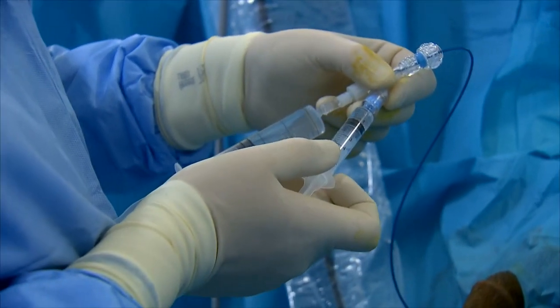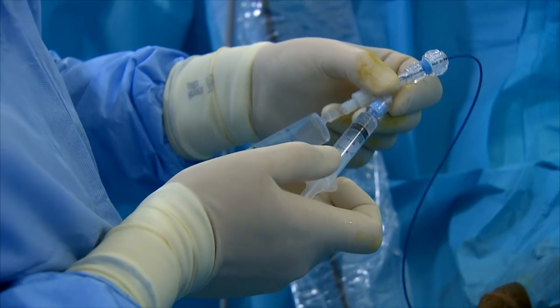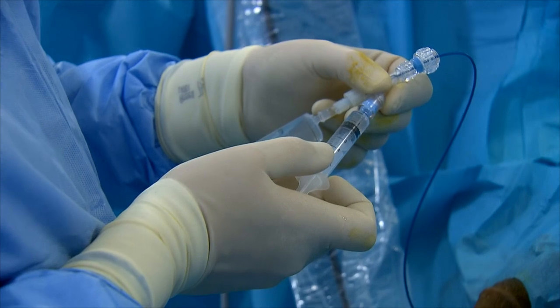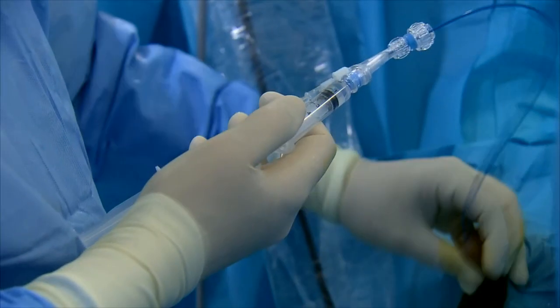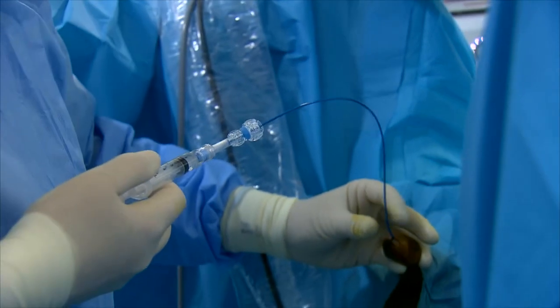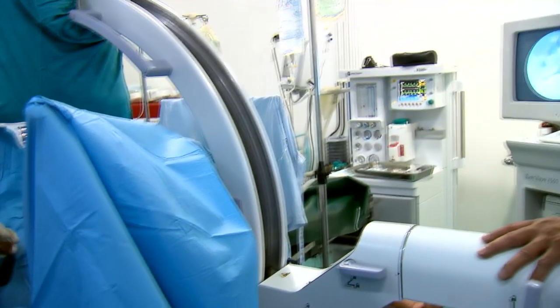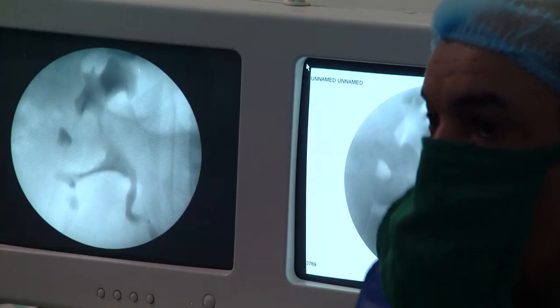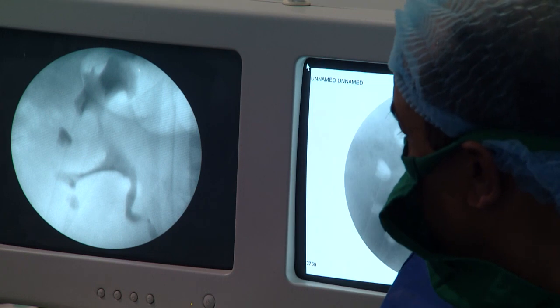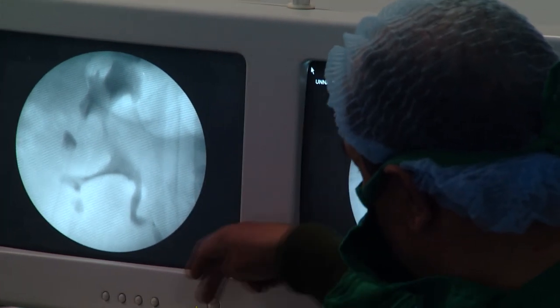And now we can show the X-ray, please. Please film the X-ray. Stop. Once more, please. Hold it here again, please. X-ray, please.